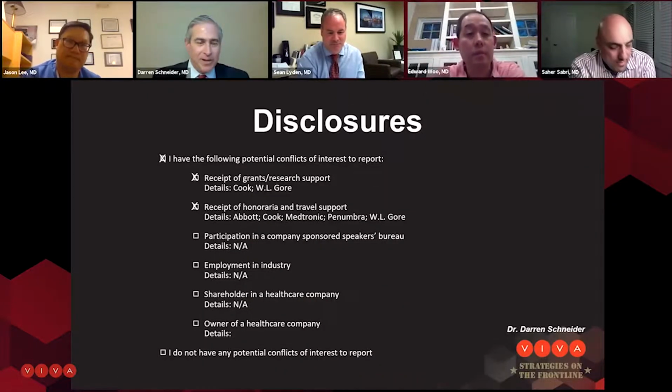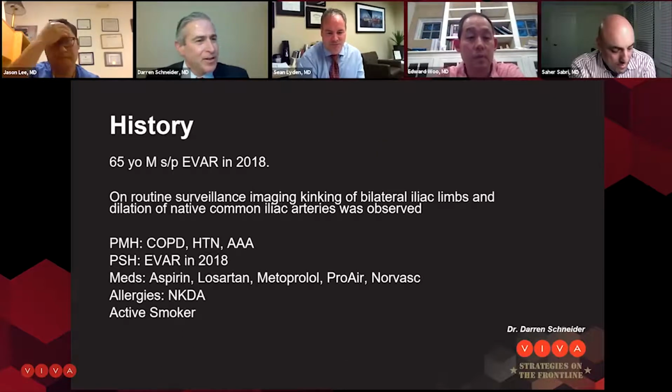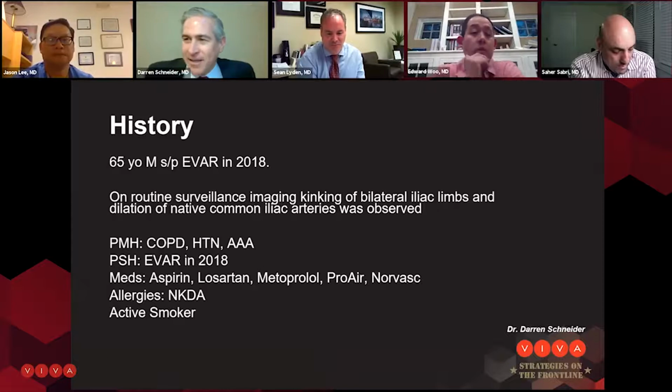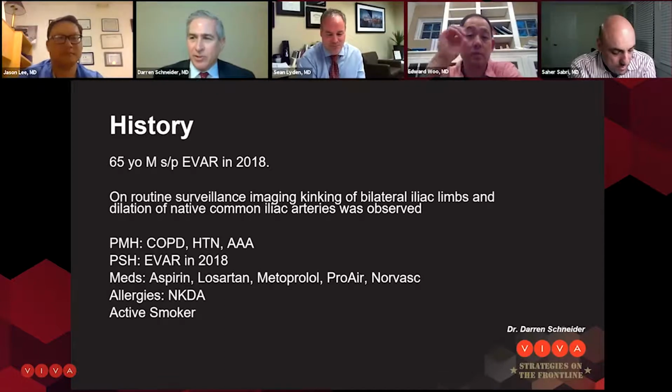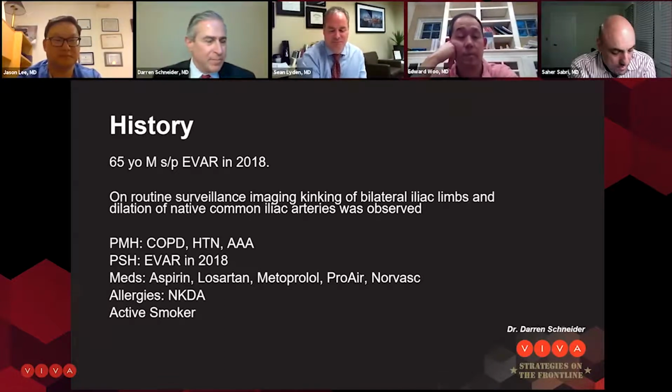So I do have some conflicts of interest there. But in any event, we're marching down the aorta, and I'm going to talk more about infrarenal EVAR and iliac issues with the iliac branch devices.